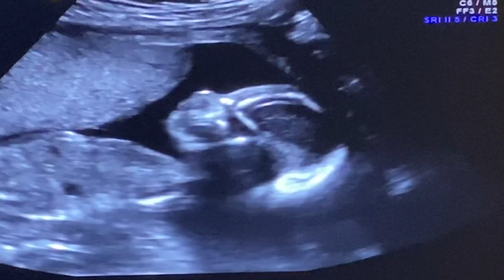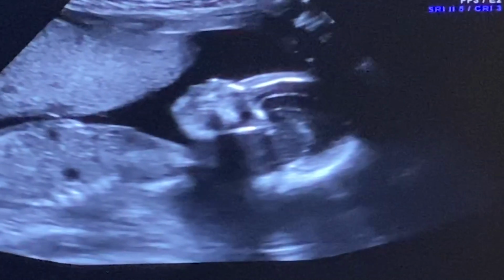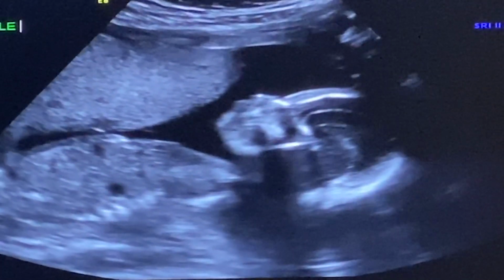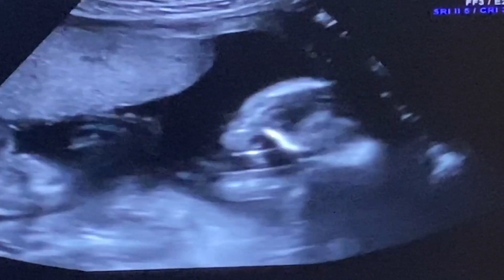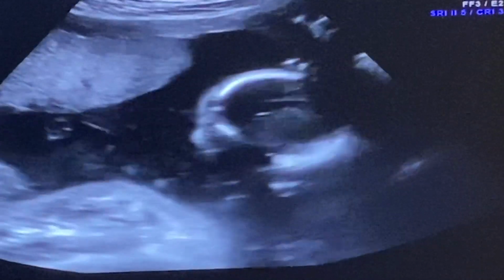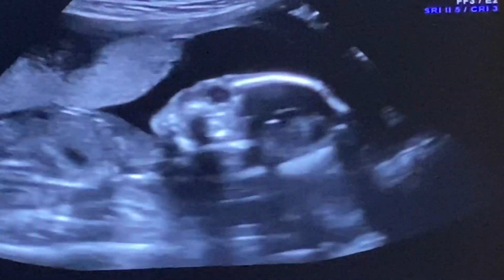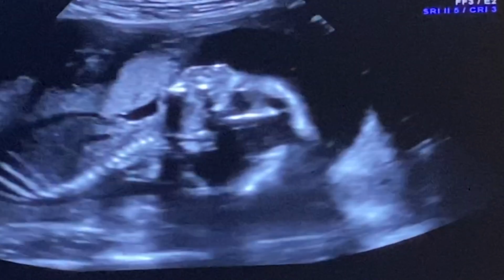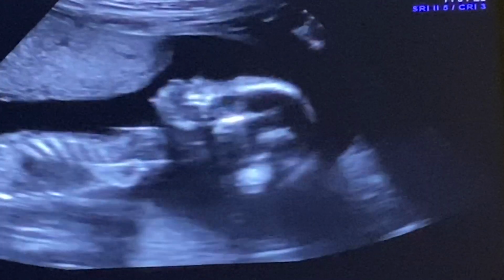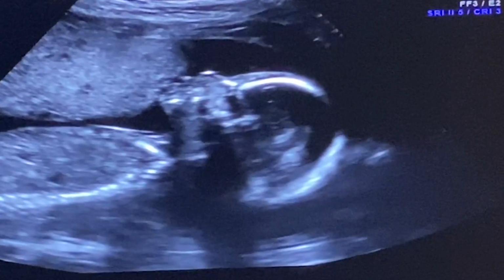Okay. You can see the little profile. That's a side view, yeah. The little side view. Maybe just turn that head again. Oh, there we go. We got a moving baby. Show us your profile. Oh, look at that. Moving the head, right? Yeah. That little profile again. Sweet baby.